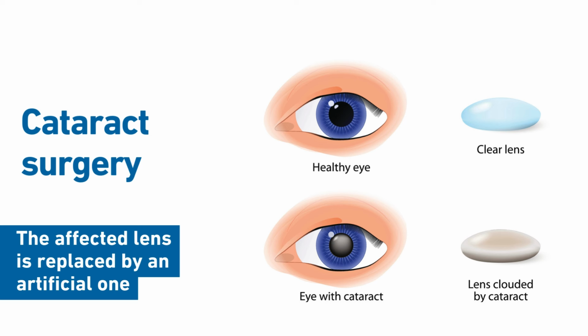I'd like to discuss with you some thoughts about how we approach intraocular lens choice. Once the decision's been made to proceed with cataract surgery, the next major discussion is what type of intraocular lens to use. We now have a range of different lenses, from monofocal to EDOF to trifocal, and sometimes the discussion around this can be a little bit confusing or challenging.